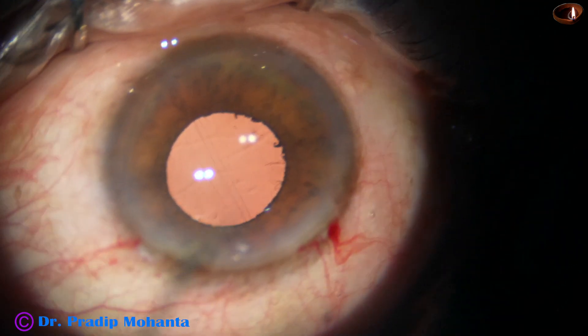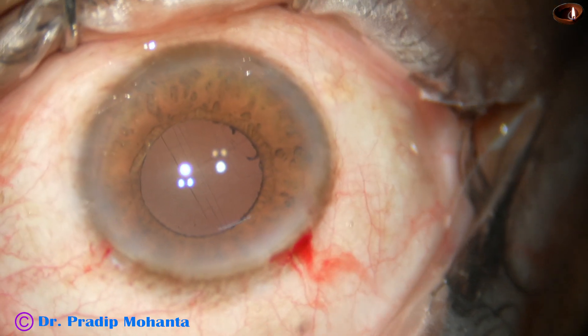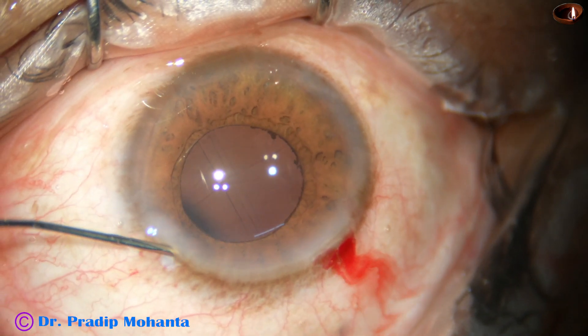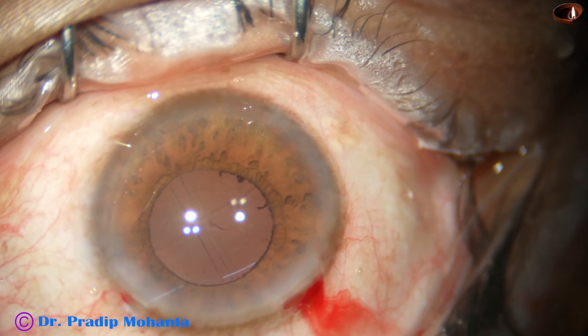We have managed this floppy iris case with the help of a pre-chopper and a Y-hook, and we have avoided use of a pupil expansion device.